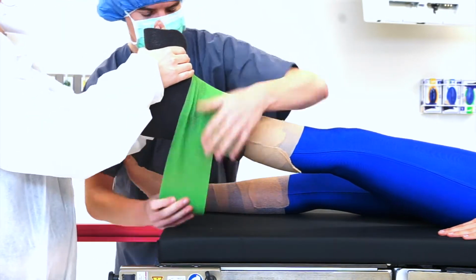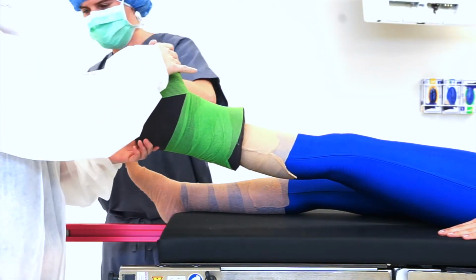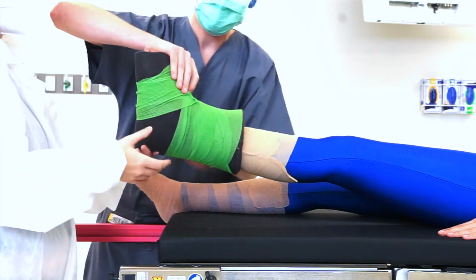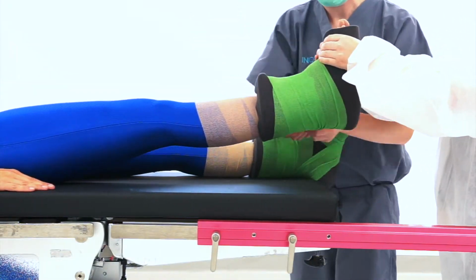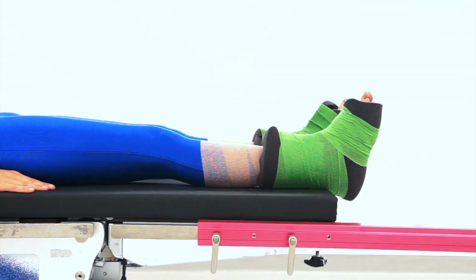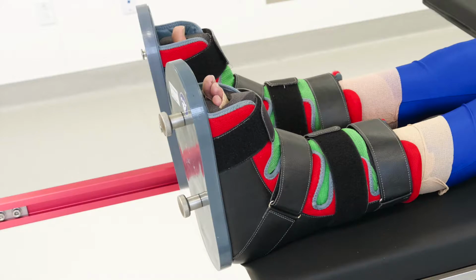Another staff member can then wrap the boot liner in more Coban. This will secure the liner and keep the foot from slipping within the traction boot. Repeat this process for the other leg. Undo all straps on each traction boot. The operative boot has knurled nuts that attach to the arch. The non-operative boot has smaller fixing knobs.